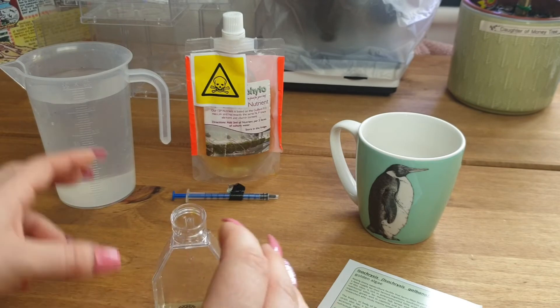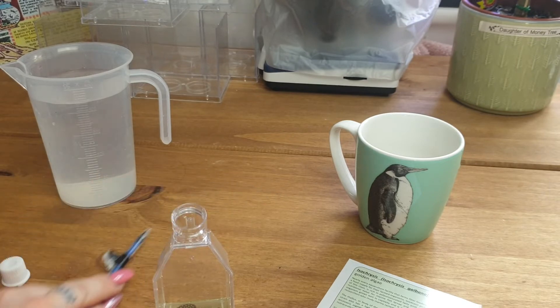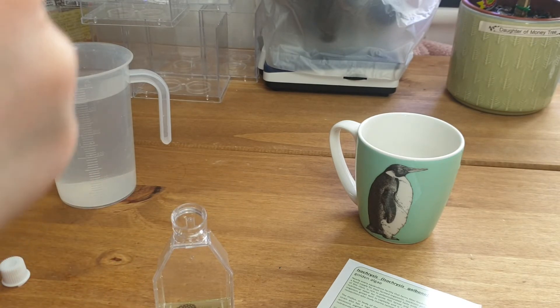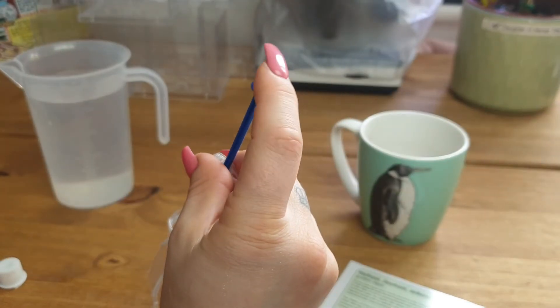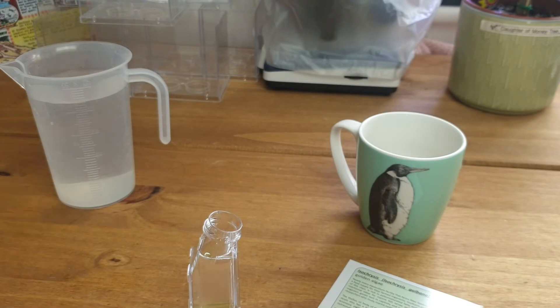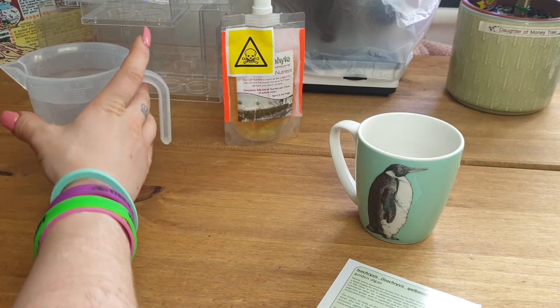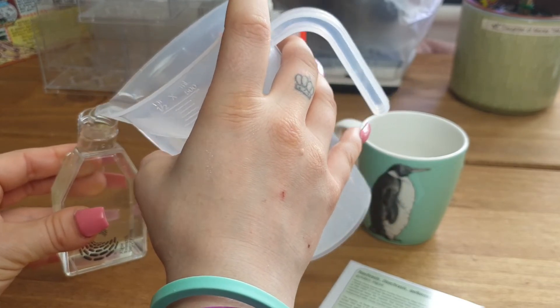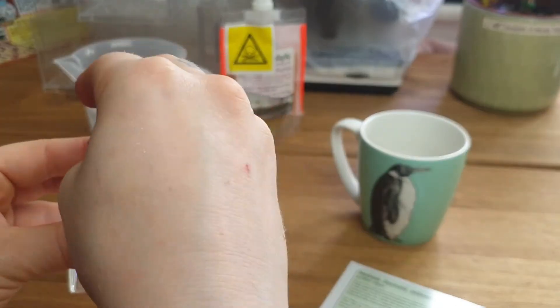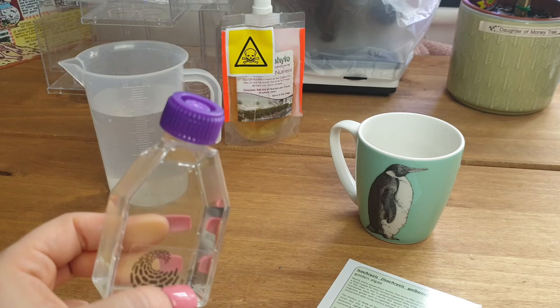We're now going to add some of the growth nutrient, which is like fertilizer you use on your garden but for algae. It gets kept in the fridge and this is from Reef Phyto. I'm going to add one mil — a nice big boost to get us started. Just pop that straight in, and then all we're going to do is top this up with the culture medium and pop on the lid. It's a very light color at the moment, but as it grows and increases in density it will darken in color.